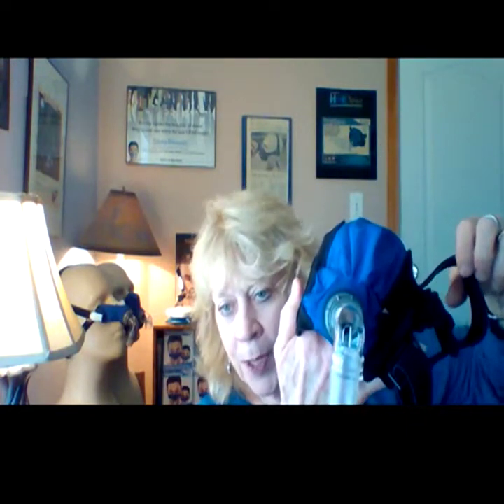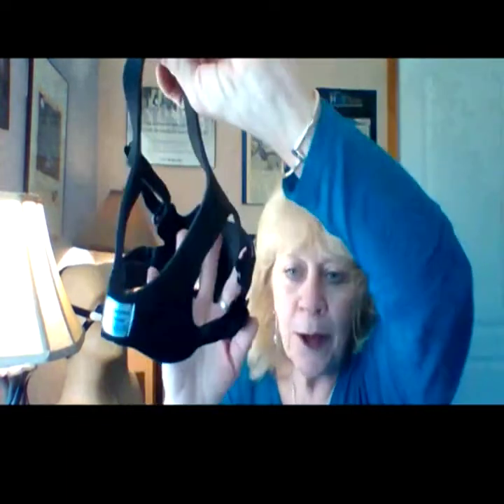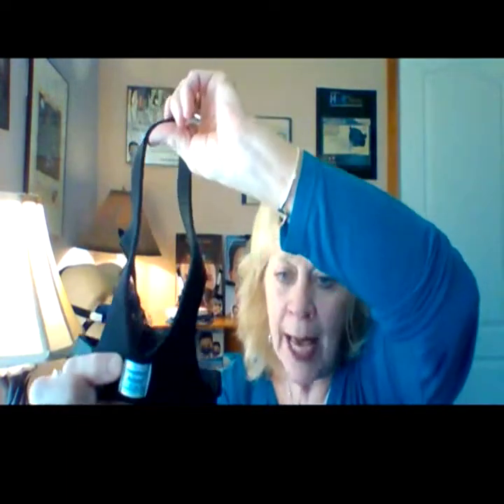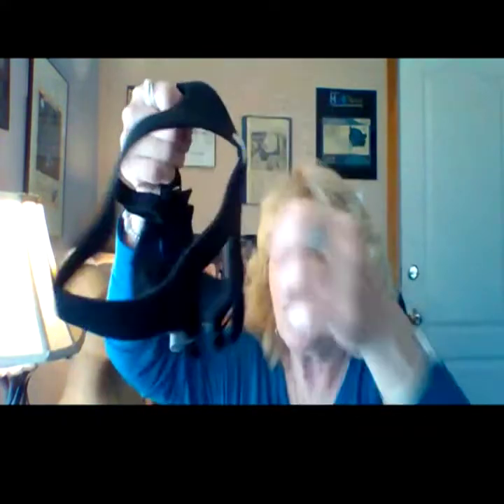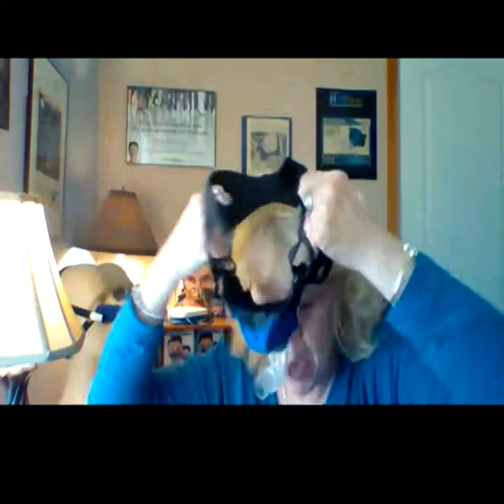This one is a little bigger than the Sleepweaver nasal mask, but it's so comfortable and it fits so well, you will not feel claustrophobic. You have a tag in the back to show you where it goes at the base of your neck, and you're going to pull it on just like you would a bike helmet.